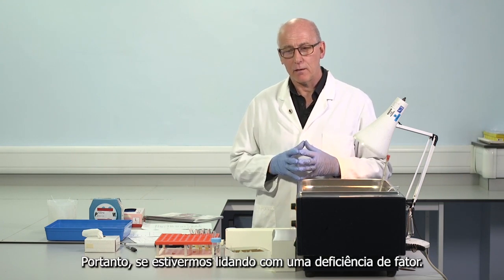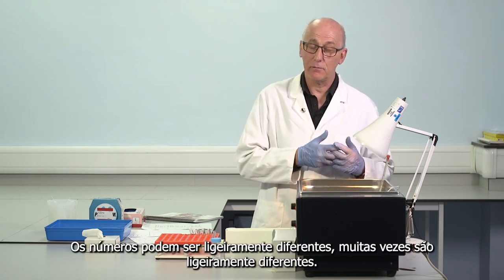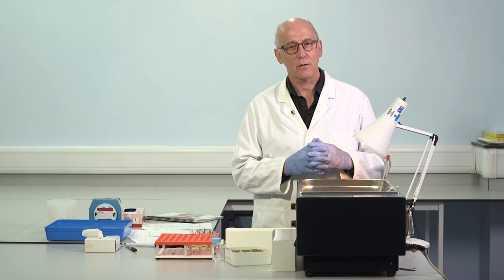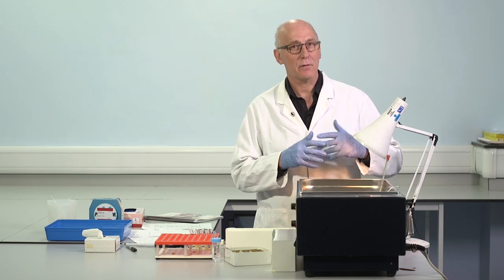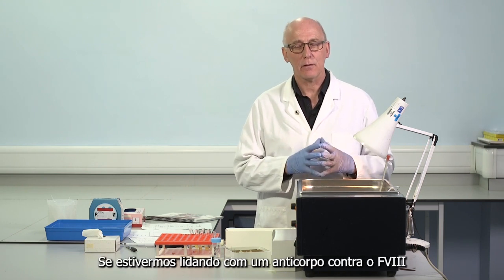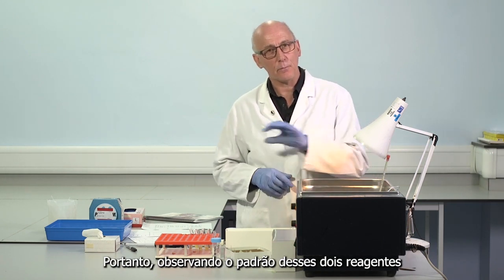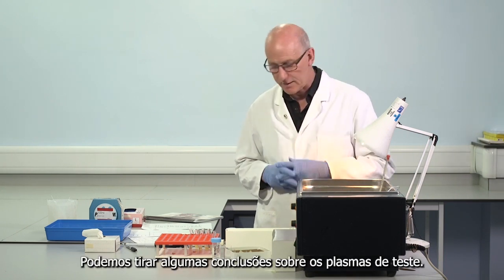So if we're dealing with a factor deficiency, the numbers may be slightly different, often are slightly different, but we will see, again, gross abnormality. Much higher phospholipid concentration. If we're dealing with lupus anticoagulant, that may have an important difference. It's likely the prolongation would be substantially less. If we're dealing with an antibody against factor VIII, we're going to see gross prolongation with any reagent. So by looking at the pattern with these 2 reagents, we may be able to draw some conclusions about the test plasmas.